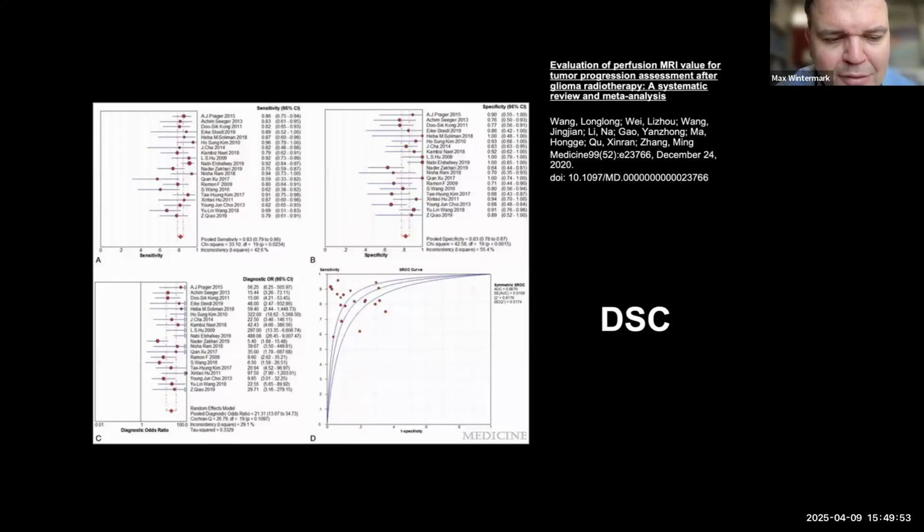The last thing I wanted to show you for perfusion imaging, and then I'll take a little break to ask if there are any comments or questions: I showed you that these techniques could be used to differentiate primary glial tumor from brain metastasis, and progression from pseudo-progression. It can also be used, though I didn't show you an example, to differentiate brain tumor from a mimic, like a multiple sclerosis plaque.